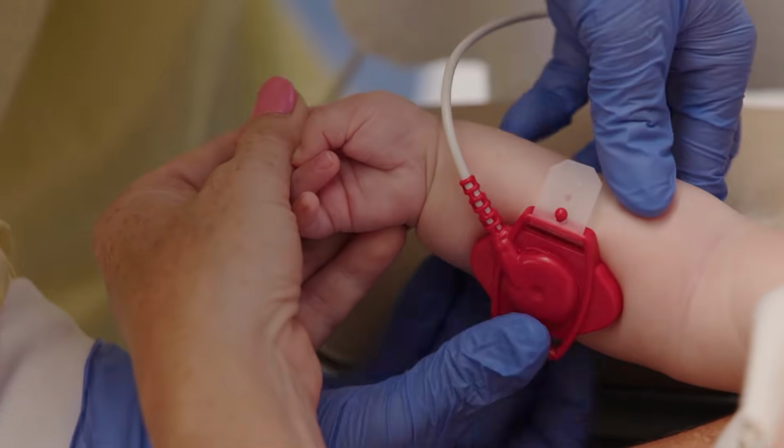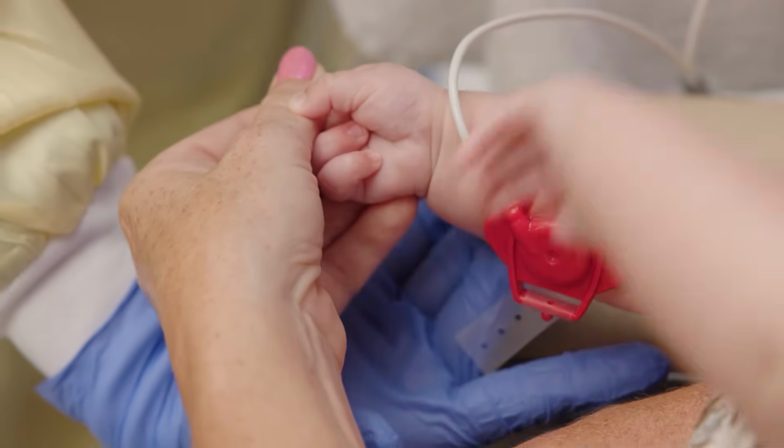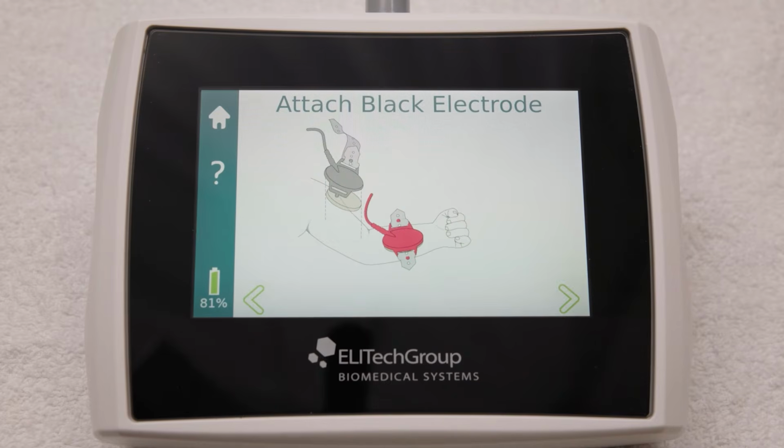If the gel disc is too loose, sometimes there is more irritation to the patient during induction. If this occurs, tightening the strap slightly may reduce discomfort. Next, repeat the process to prepare and place the black electrode.